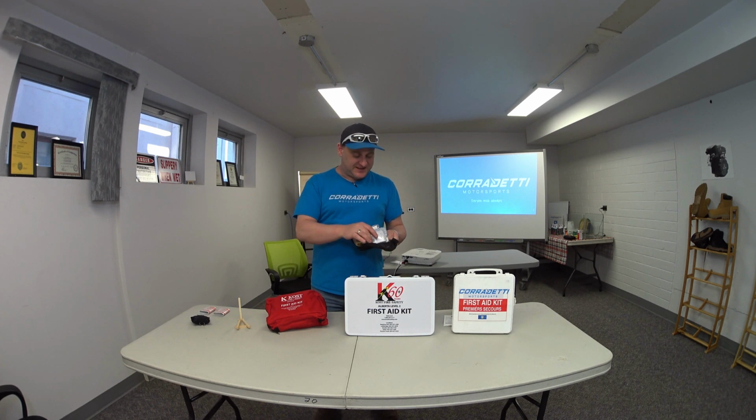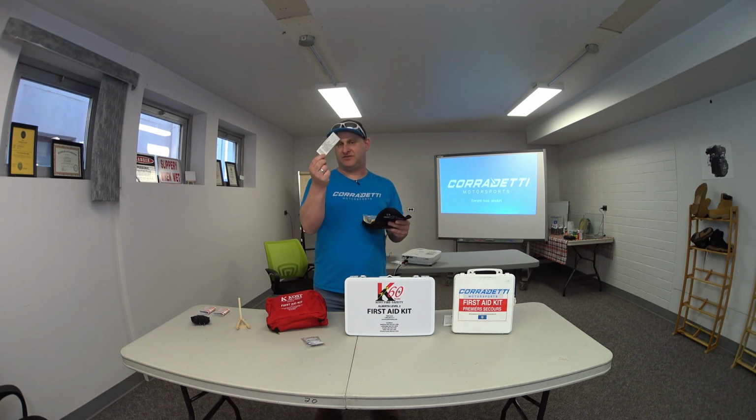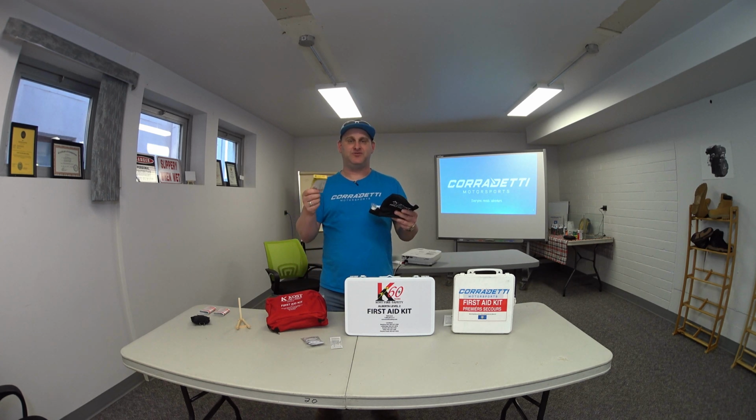What do you get in a P? Well, you get very little. Again, you get your alcohol wipes. You'll get a list of what's inside it. So if you do use any of the items in there on a small first aid matter, you could go and see what you need to replenish. It'll also give you a triangular bandage. So if you're tending to a broken arm or you've got to stabilize an arm, they'll give you a bandage.